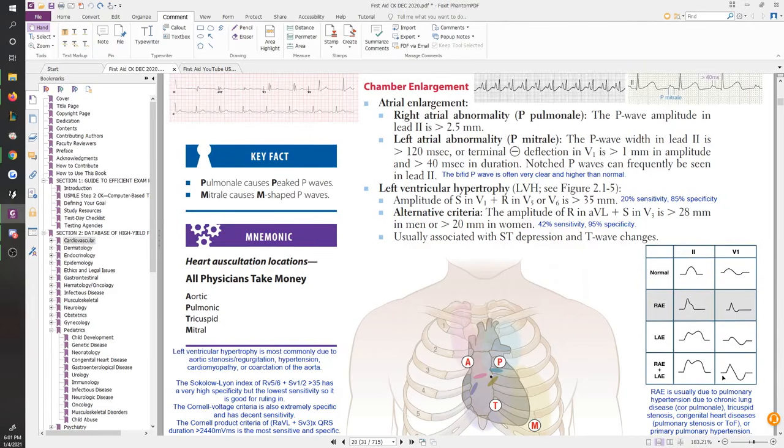If you have both, that's something that's almost never really going to be a question, because if it is a question, if you have someone who has atrial enlargement on the right and the left side, then an ECG alone is not going to be diagnostic enough, because as you can see, both of these look very similar. There's actually no difference. The only difference you're seeing here is the fact that one is more accentuated than the other, but on your step 1, you're not going to have one to compare to another, so you're not going to be able to see how accentuated it is.